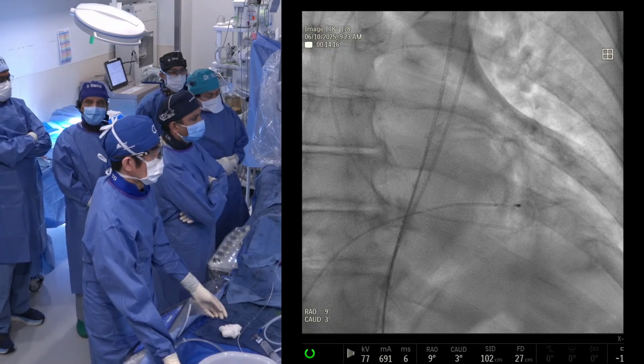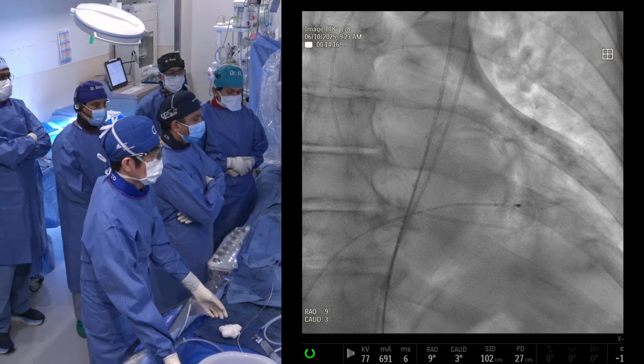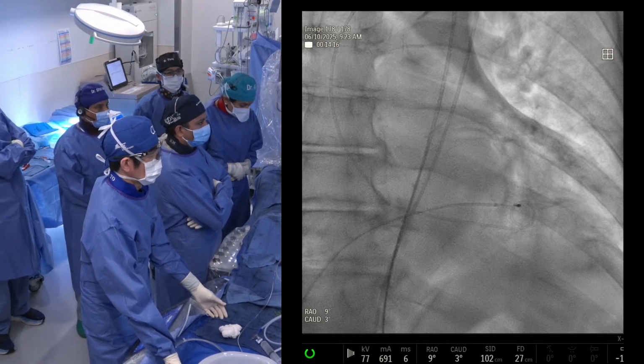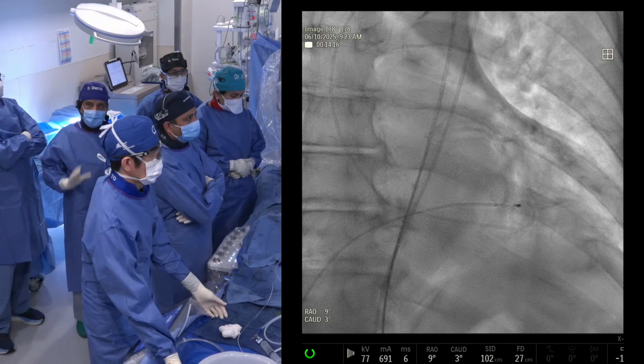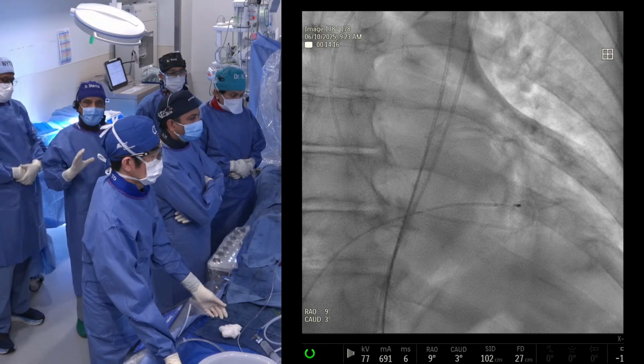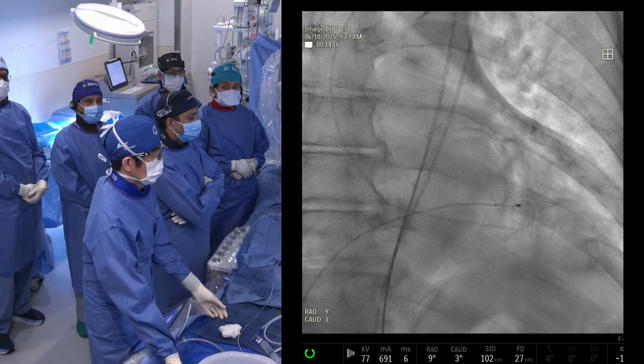Whether it will translate to other surgical valves as well as the TAVR valve needs to be seen. But by and large, we have learned that for both TAVR and SAVR, valve degeneration or valve longevity is identical in those compared cases.